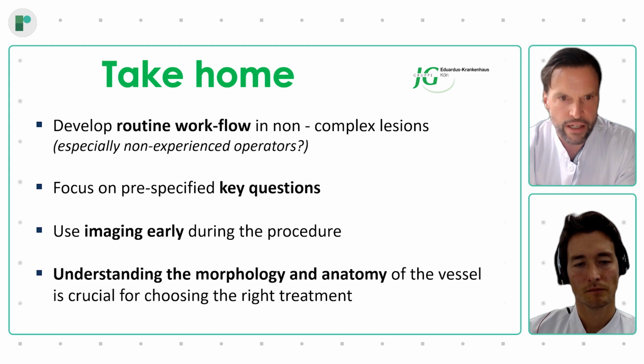And I think the study that we showed was very impressive, that the use of intravascular imaging is even more important in non-experienced interventionalists.